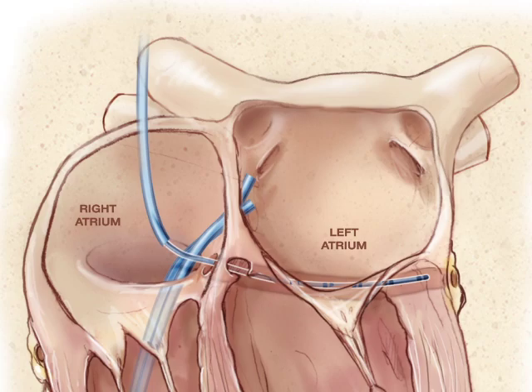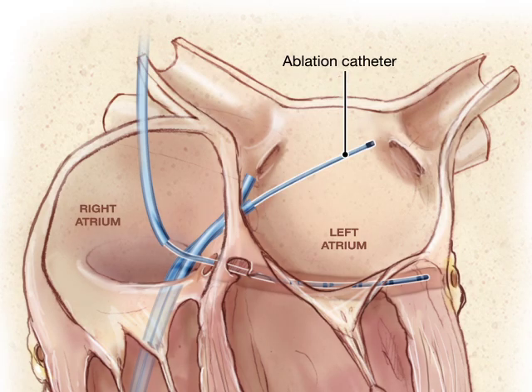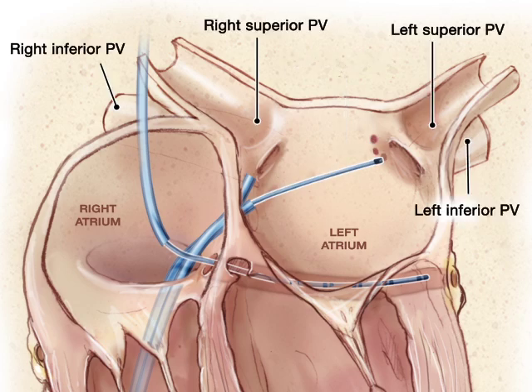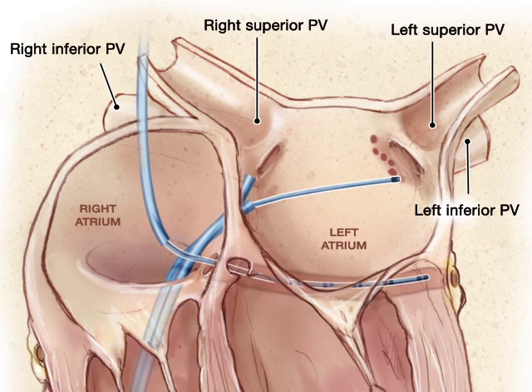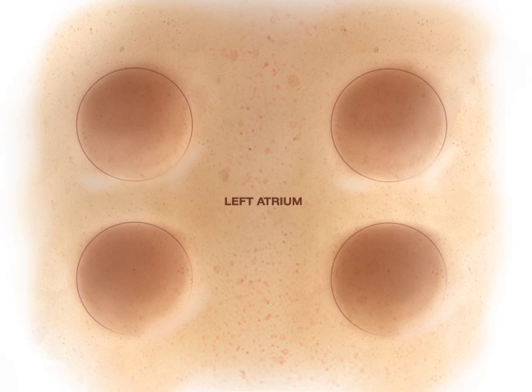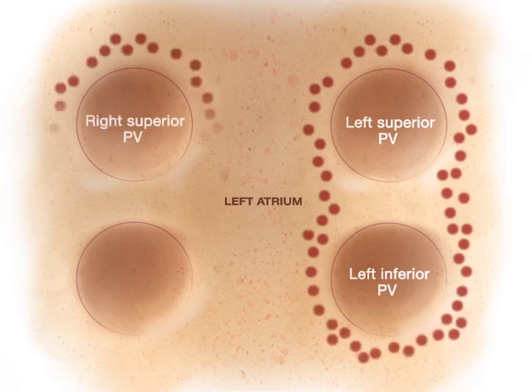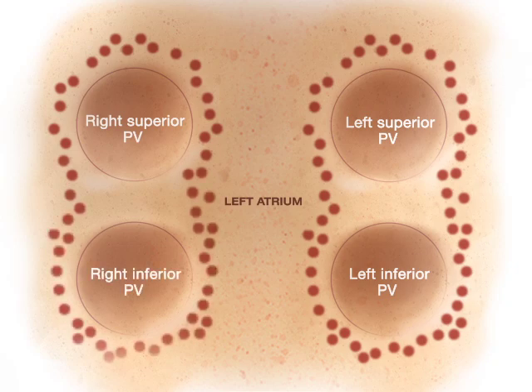Now navigating inside the three-dimensional reconstruction with occasional reference to fluoroscopic images, the operator performs a series of point ablation lesions in circles outside the pulmonary veins. This is primarily done using anatomical references, although the electrogram from the ablation catheter itself is monitored. Typically, a large ablation ring is first made around both the left superior and left inferior pulmonary veins, followed by another large ring around the right superior and right inferior pulmonary veins.